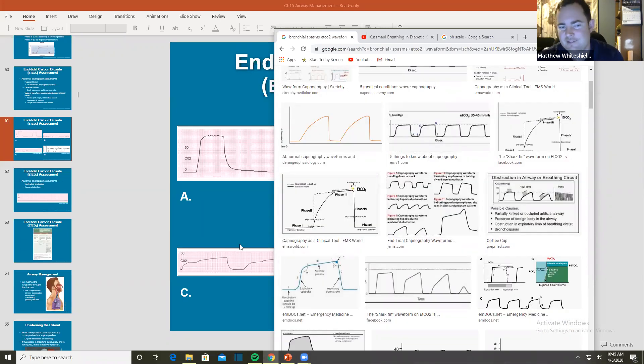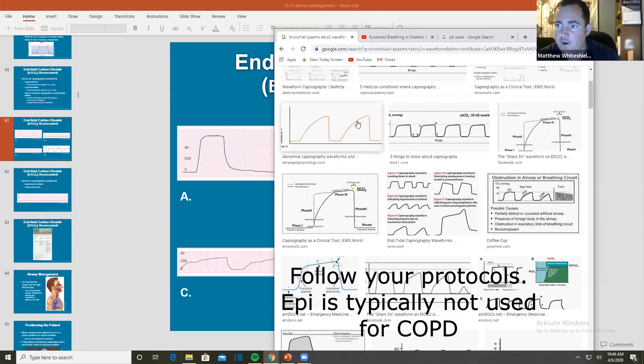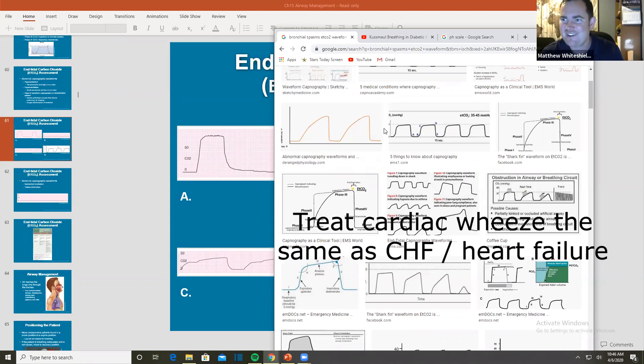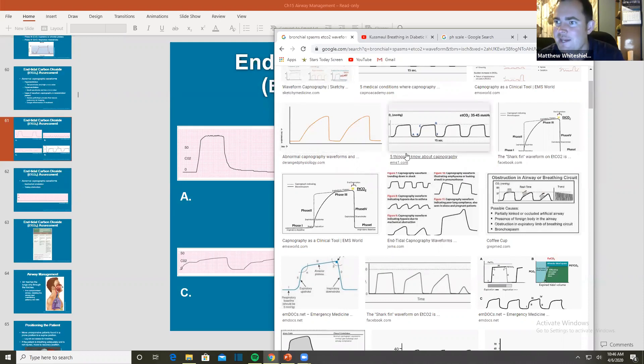I'm telling you now, use your waveform capnography to make those decisions. I call it shark finning. That is associated with lower airway obstruction, wheezing, asthma, anaphylaxis, COPD. Has nothing to do with cardiac. If I see shark finning, I treat with a bronchodilator. So I'm giving this patient albuterol, atrovent, solumedrol, mag sulfate, epinephrine. That's when I see shark finning. If I do not see that, but I hear wheezing and my patient has history of heart issues, I'm not treating them for asthma. That's a completely different ball game. But if you don't understand how to read your end-tidal capnography, you're going to miss it every single time.